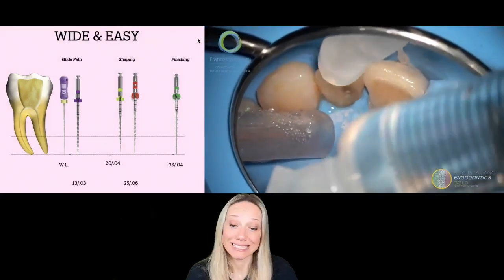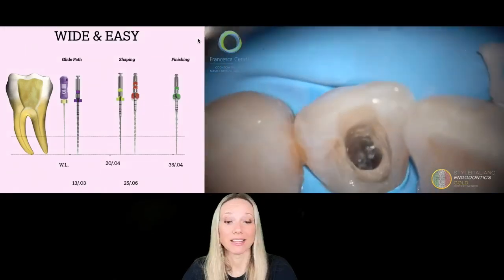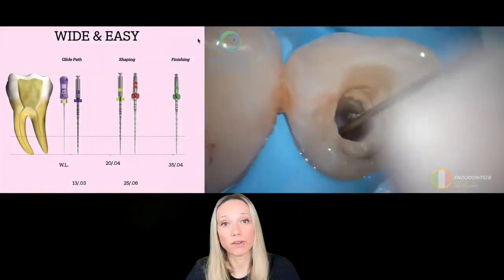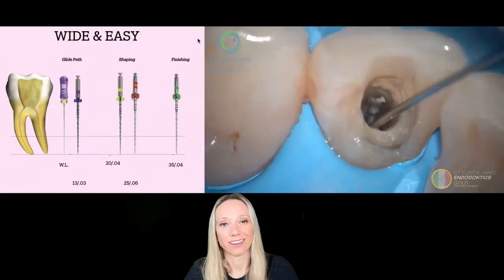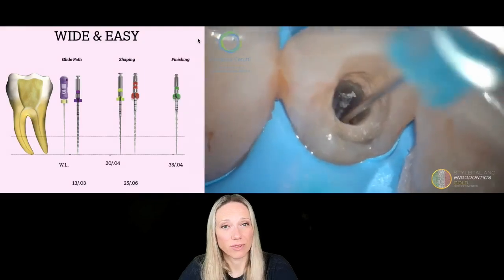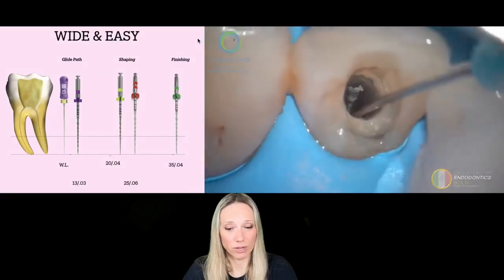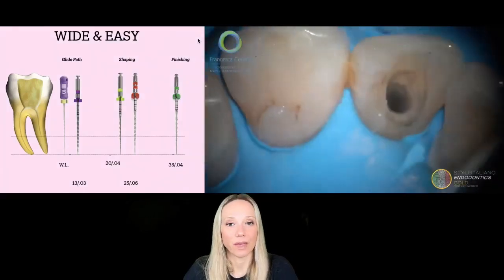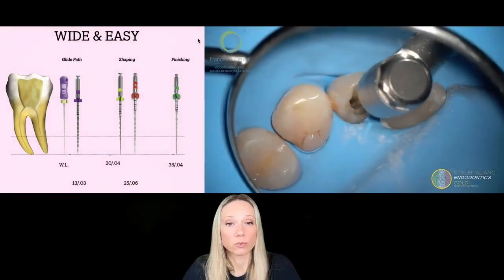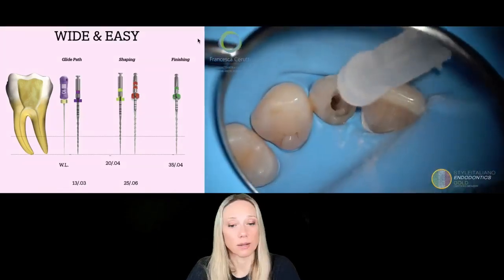In this case that I'm showing you, it's a little bit more complex because it's a retreatment. And so what do I find? I find a thermophil that is stuck at the apex, so I have to remove it. I remove it with a loop technique because it's very, very engaged, and I'm finding a difficulty even with the loop to make this plastic come outside from the root canal. But when I make it, I found a straight canal, pretty broad, and so what do I do? I take directly my 1303 and I bring it to the working length.